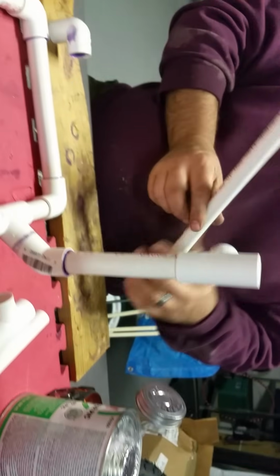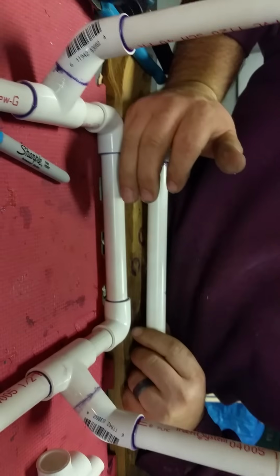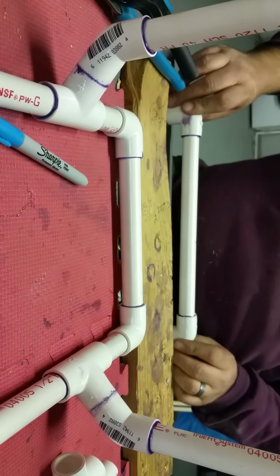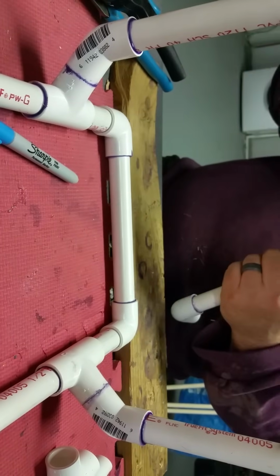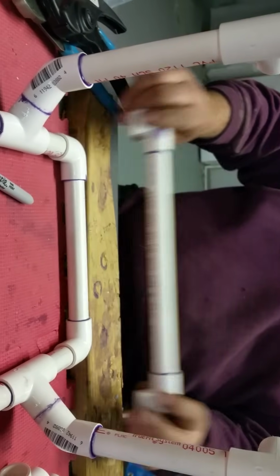Here the same procedure applies. We're putting this bar together just like the back bar and the belly bar. We want to make sure that it's straight, that it doesn't wobble. And this is our 11 1/4 inch bar that's going to sit below the back bar and offer support to the cart.